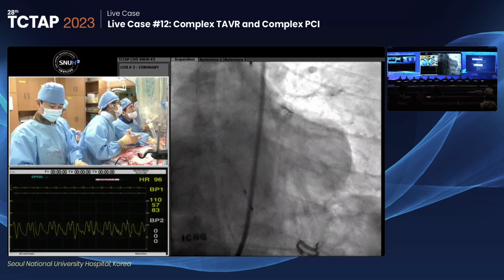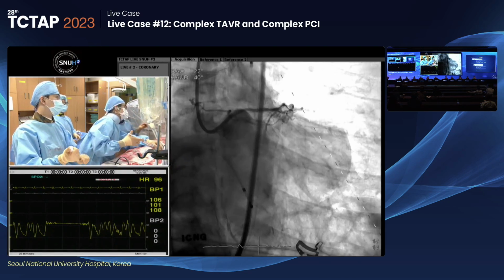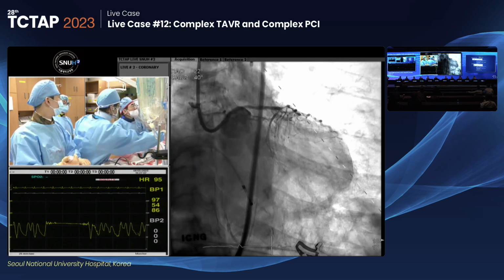Is there a reason that you go 1 to 2 in a balloon pump and not give them even more support and go 1 to 1? Seems like you're just on 1 to 2.